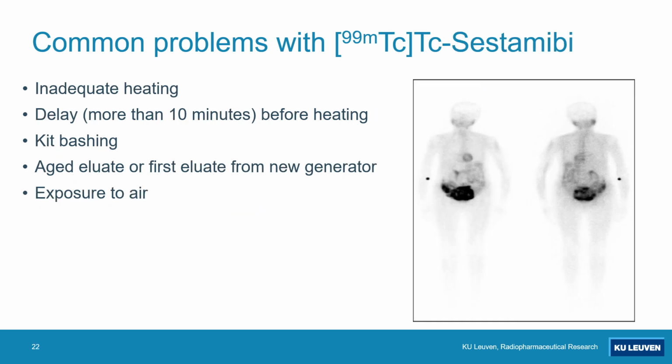Problems with the technetium system, maybe also the heating, the delay before heating. So you just add your technetium, but you do not put it in the heating water bath immediately. Kit bashing, old eluate, exposure to air. So it comes down to the same principles all the time.